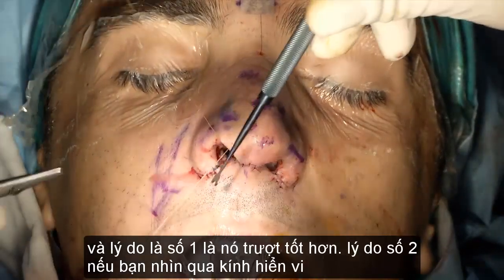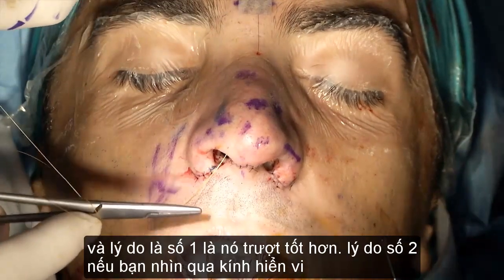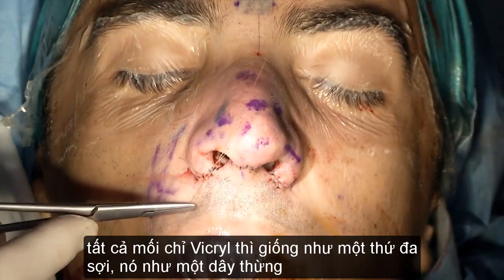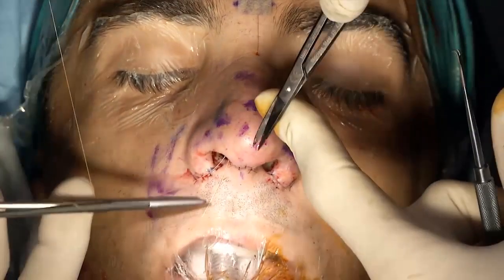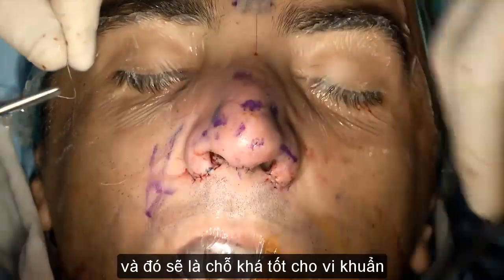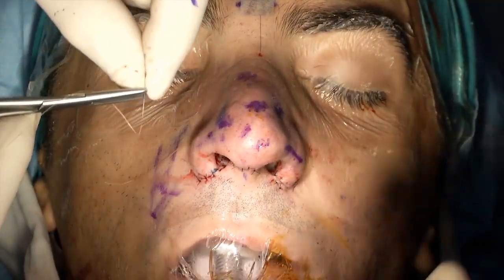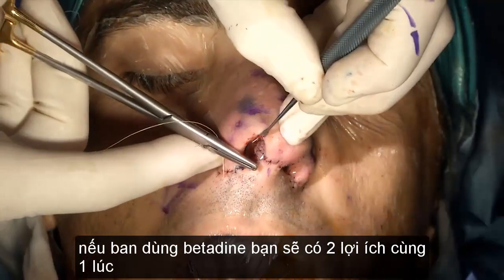And the reason is, number one, it slides better. Number two, if you look at it under microscopy, a Vicryl suture is like a multi-fiber thing, like a rope, and that's a place for bacteria, so if you betadine it, you are having two advantages at the same time.